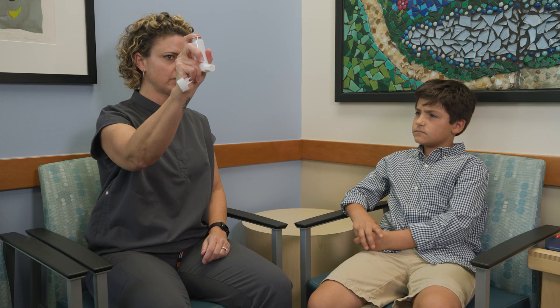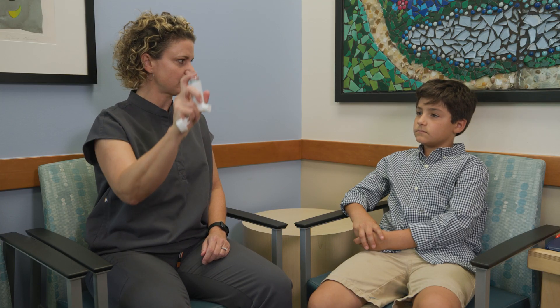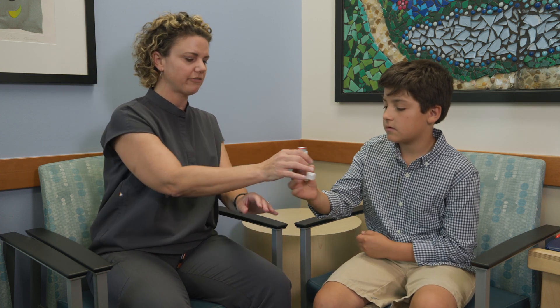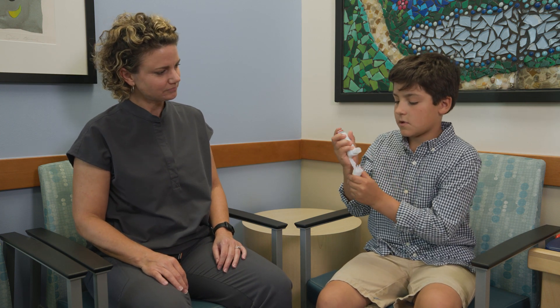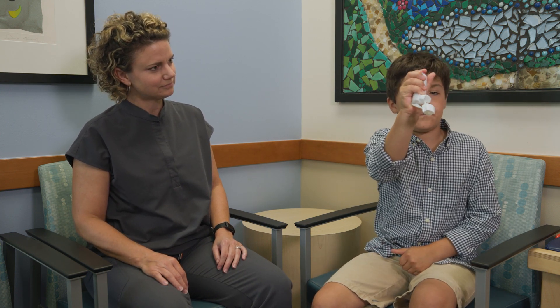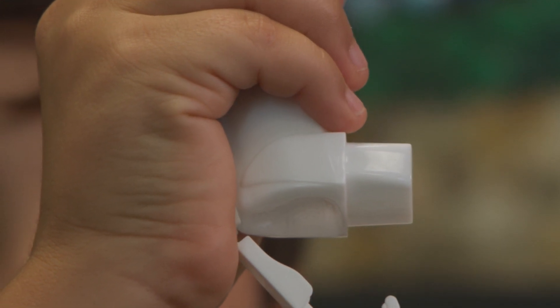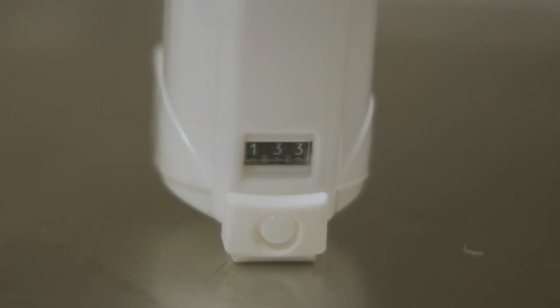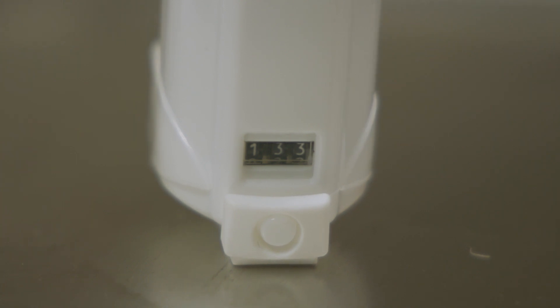Before you use the inhaler for the first time, or any time it has not been used for two weeks or more, it is necessary to prime the MDI. To do this, you simply shake the inhaler, then spray two to four times away from your face. These puffs do not count towards your medication dose, but you should see the counter on the back go down by the number of puffs used to prime the inhaler.